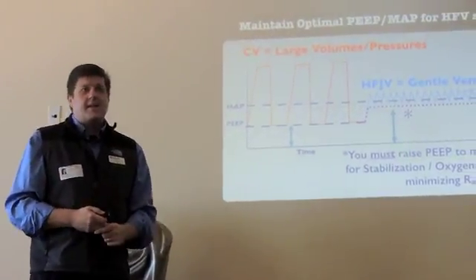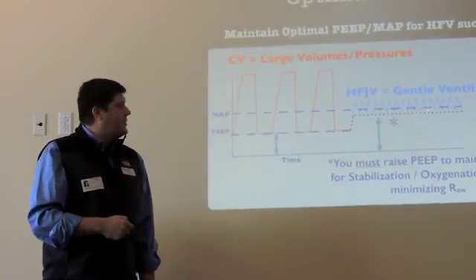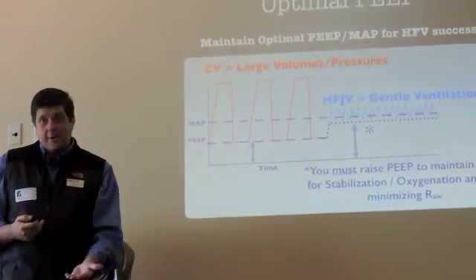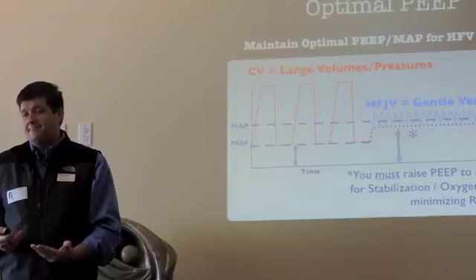Does a PEEP of 10 sound scary? Sometimes. I mean, I visit a lot of hospitals where that's very, very scary to them. But if your mean airway pressure is only 12, what are you worried about? See why you have to look at the mean airway pressure on the jet and stop freaking out so much about what the PEEP is, okay?